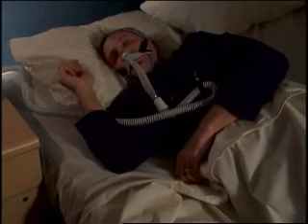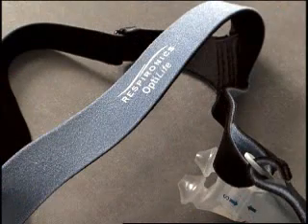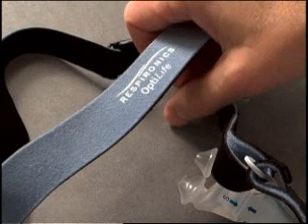Once the mask and headgear have been properly fitted for seal and comfort, the OptiLife interface can be put on with one hand. To place the mask on with one hand, take hold of the headgear where the Respironics and OptiLife names appear on the back.